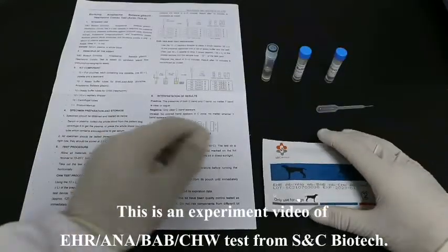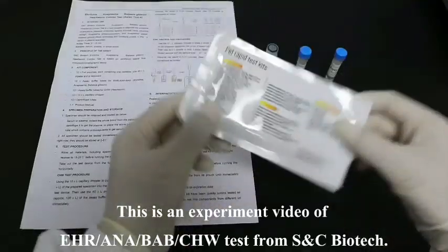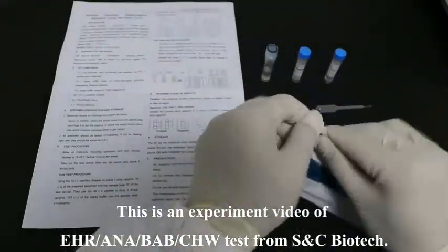This is an experiment video of a Lekia, Anaplasma, Babesia gibsoni, and heartworm combo test from S&C Biotech.